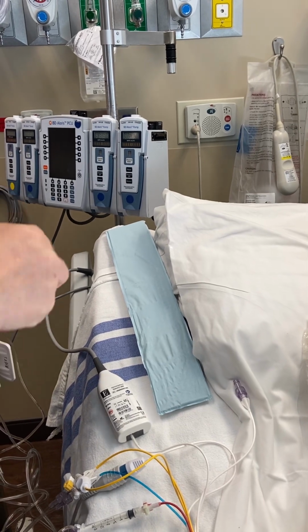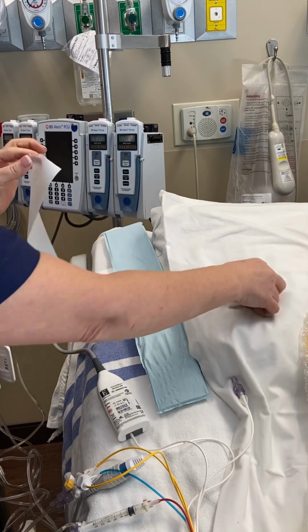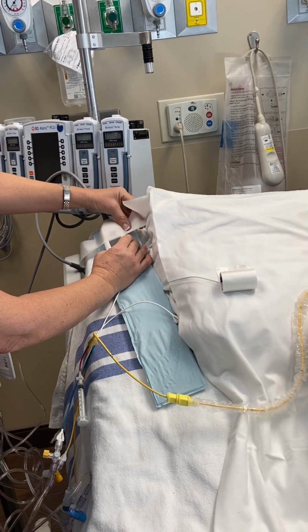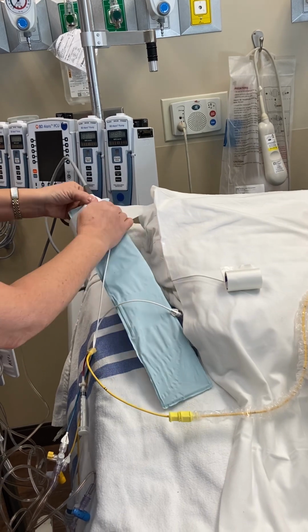So what takes place when the patient arrives, after y'all get things settled, the anesthesia will start with a report first, then Craig will start a report after that, and then Dr. Hoffman will give you a report. So all that is kind of going on while your secondary person is taping your Swan.